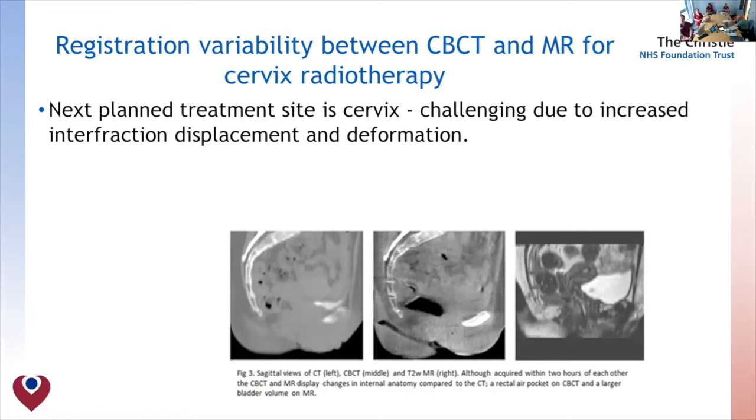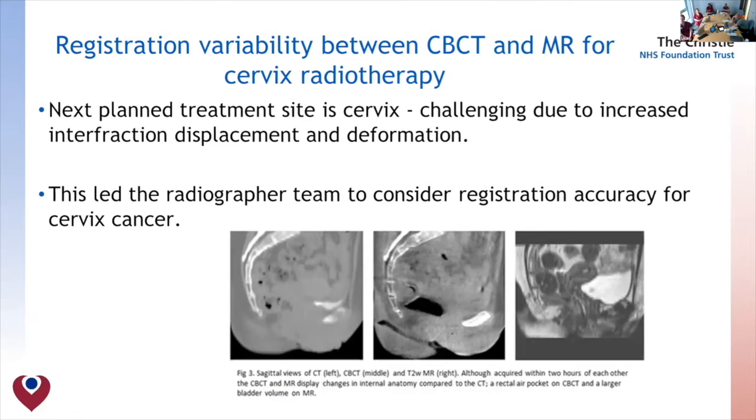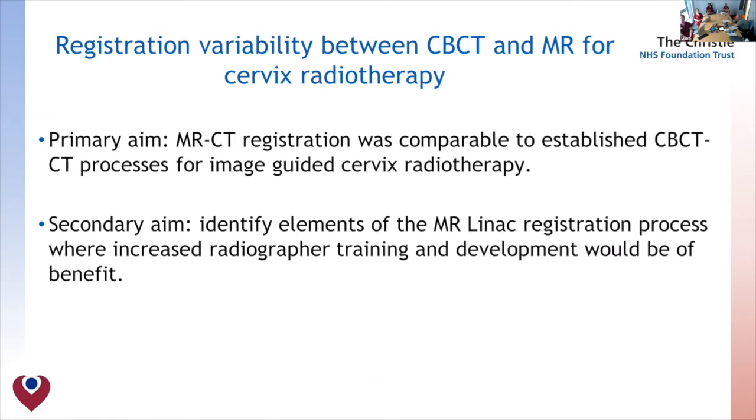So we did feel it was important to quantify image registration agreement, and we wanted to establish that prior to implementing cervix as a new clinical site for MR-guided radiotherapy, that MR registration was comparable to established cone beam CT processes. We had a secondary aim as well, and that was to identify elements of the registration process where further training would be of benefit for the radiographers.